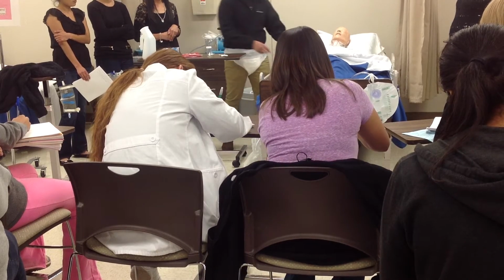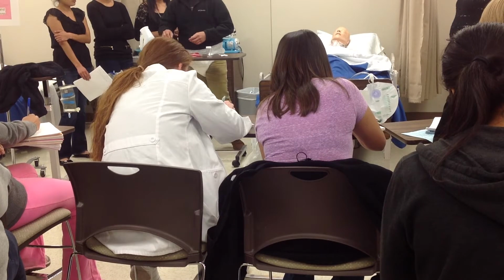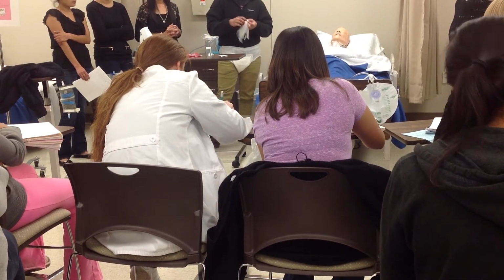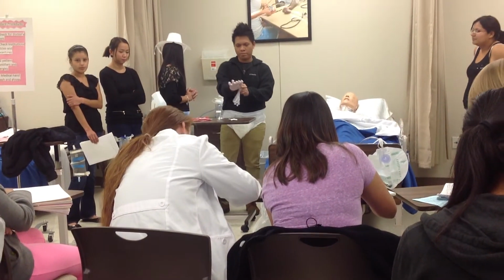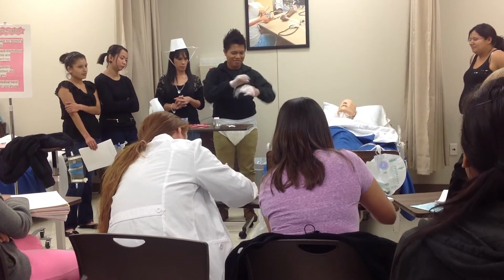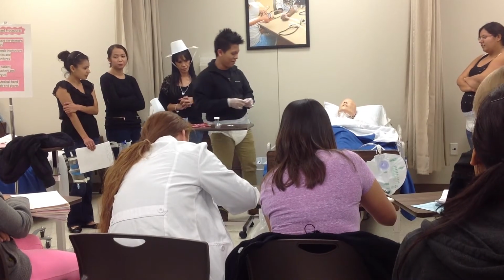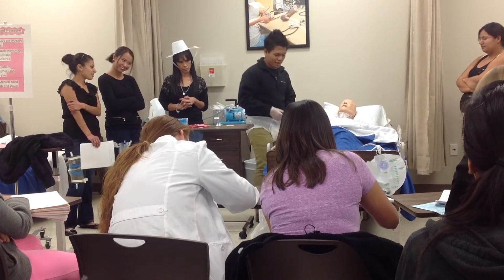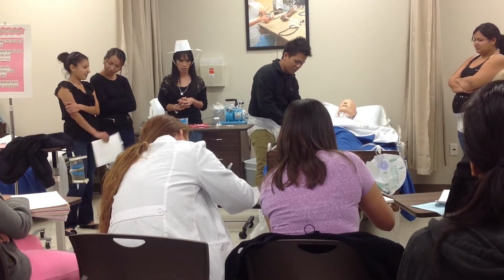So we're gonna go ahead and get our syringe. And the first thing we're gonna have to do is wash our hands. I don't have my hand wash, so let's just pretend. So I'll go ahead and put my gloves on. Alright, get your alcohol swab and clean the port. There should be like a port where you can actually get the specimen at. So just go ahead and open it. Then clean the inside and outside part.